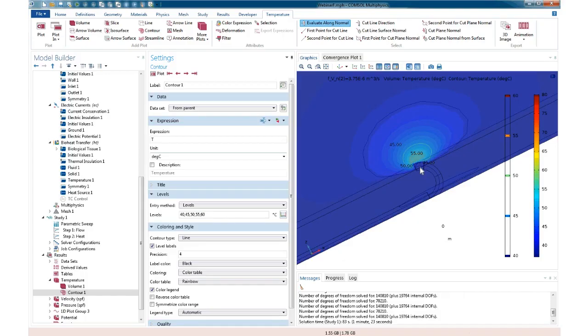As we increase blood flow a little bit more, not surprising, everything gets cooler, so our lesion changes size. So what does this give us in terms of insight? The insight here is the heat sink from the blood is so powerful that it completely moves our lesion away from where we think it's going to be and detaches it entirely from the electrode. The other piece of insight we get is, not surprising, if the body throws more blood flow at us, our lesion changes size.